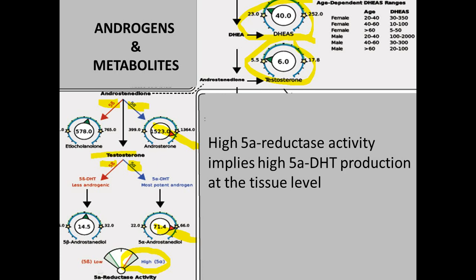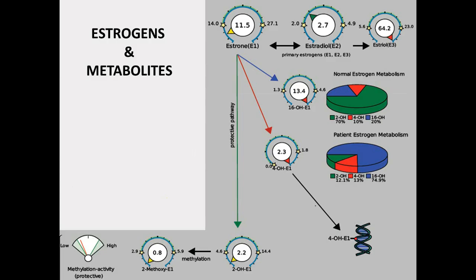You can see testosterone's low normal, but a lot of it is pushing through this DHT pathway, and so we want to look at that overall picture. That's an advantage of this test, especially in your young, hormonally imbalanced patients, people with PCOS, and for the male patients, when we're looking at prostate issues, it's relevant as well.